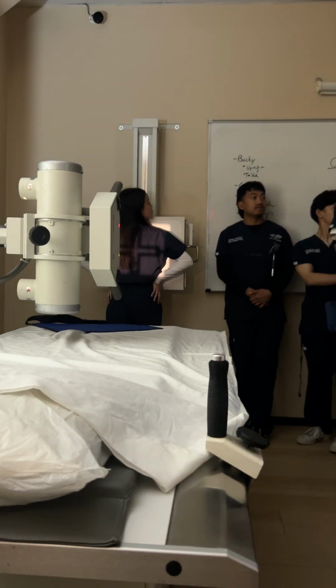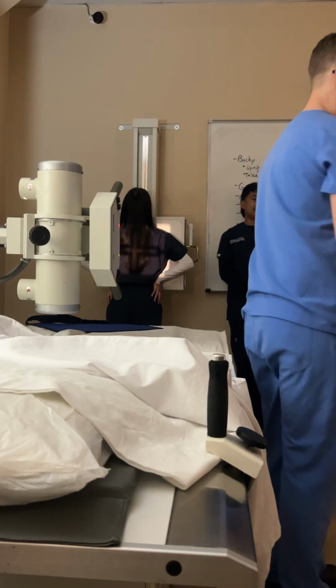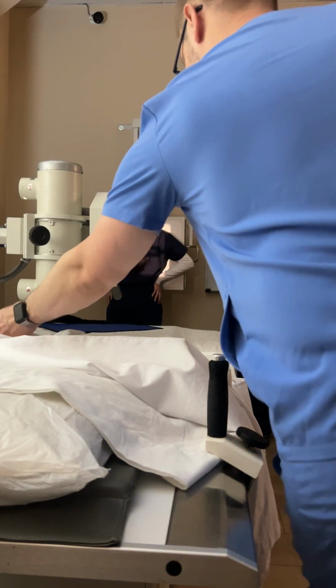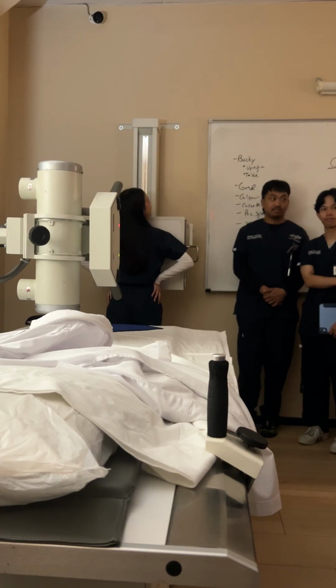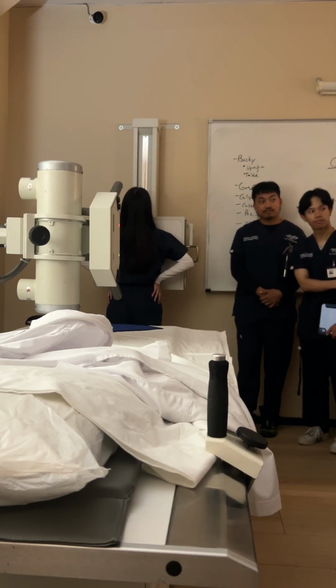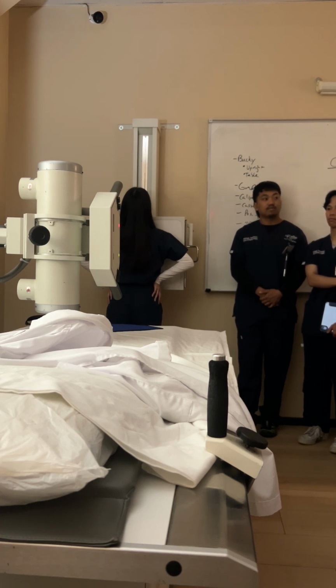Just a second. Great. So we're centered. We're ready to go. What is the instruction now? And give her that instruction for me, please. You said to, I'm gonna take 2 pictures of your chest, and you said to take a deep breath in and blow it out and do it twice, and then the second one you hold. So give her the instruction.